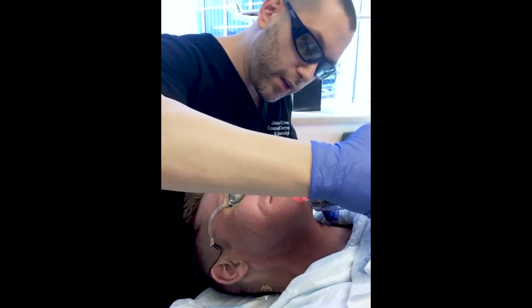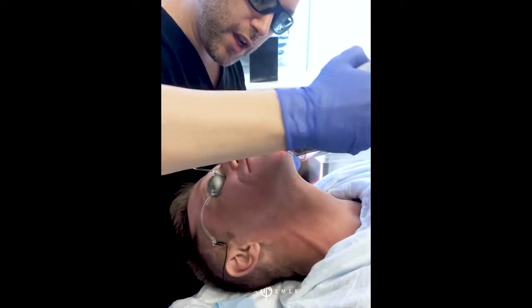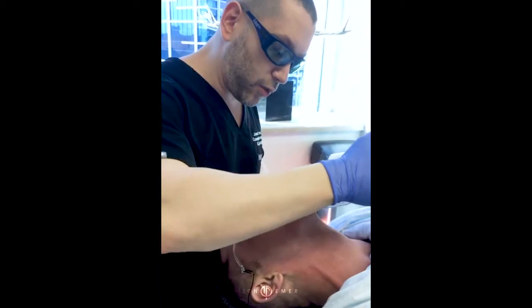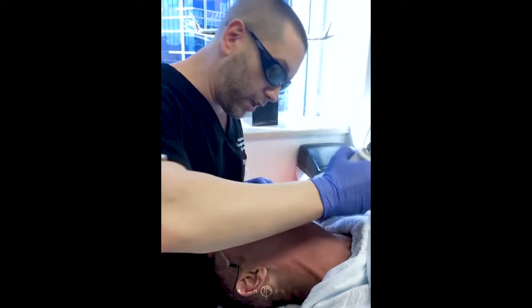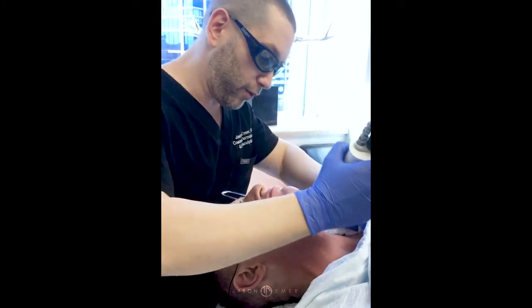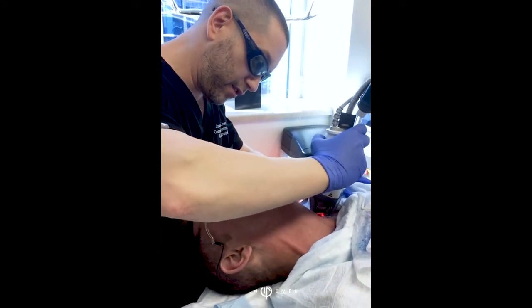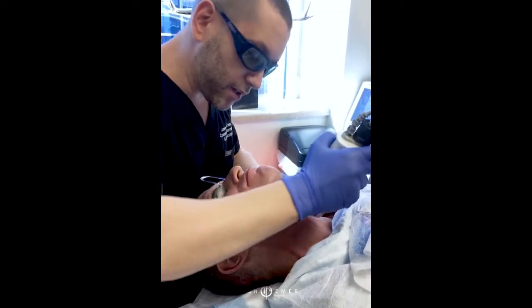Perfect. Over the next, chin up all the way. Yeah, cool. What's the post-treatment care? So post-treatment, we always do an enzyme exfoliation for 3 to 5 days, vitamin C and vitamin B, and something called dermal repair cream from Sente. It's one of our favorites. We don't use anything occlusive, and we don't do anything that has a petrolatum base.